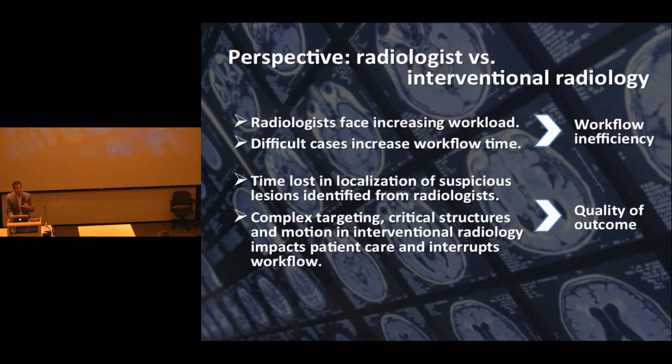And what we're looking for is really to bridge the gap between the work from the radiologist and translate that into the interventional setting, to fuse information that was planned before the procedure in the operating room or in the interventional room.